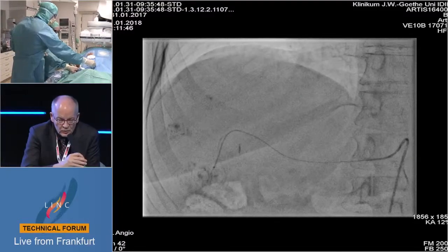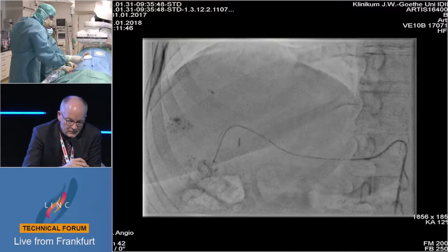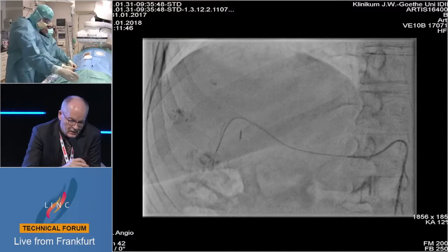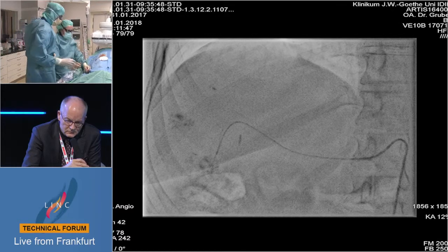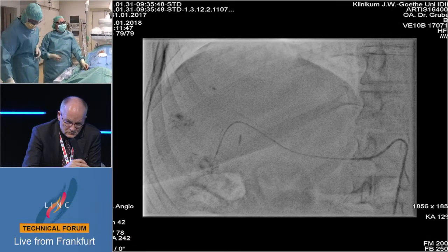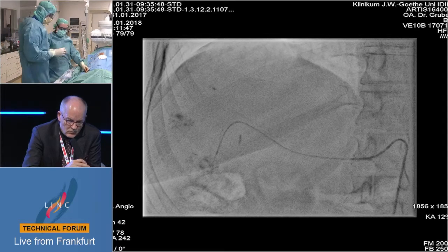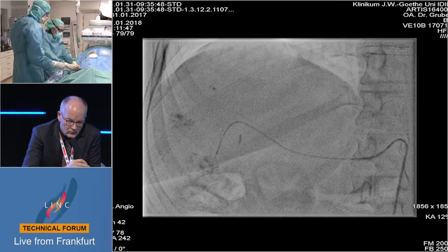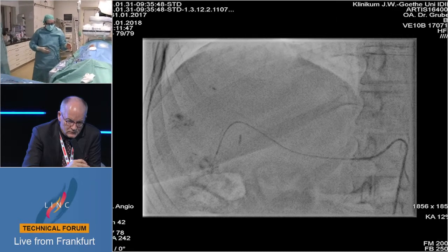Now we are very selectively in the vascular territory for this segment 6 lesion. Segment 6? Yes. So what is your next step? You can see the lipiodol. This is the application of mitomycin C and lipiodol.